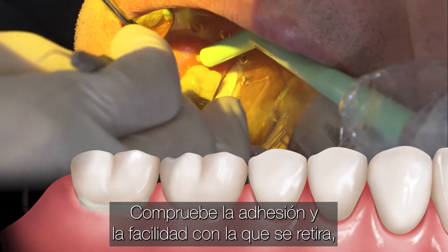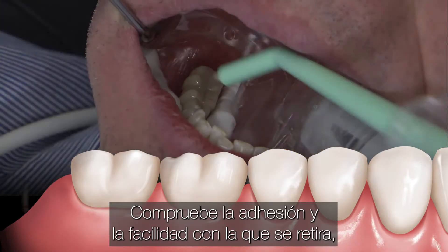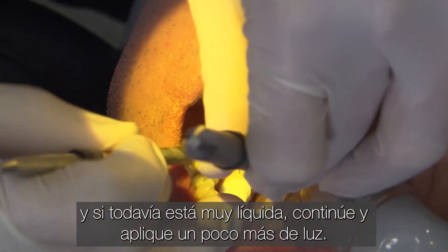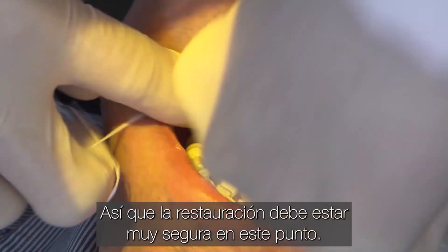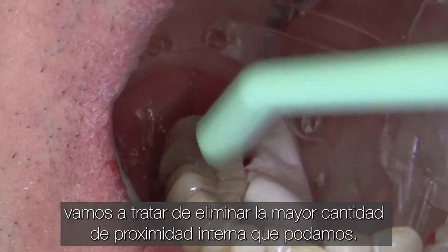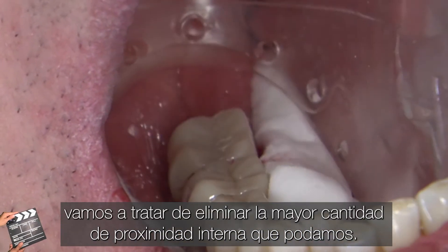Check to see the tack — how easy it is to remove — and then if it's still very runny, continue and apply the light a bit more. The restoration should be very secure at this point. Using floss with a knot in it, we're going to try to remove as much excess as we can.